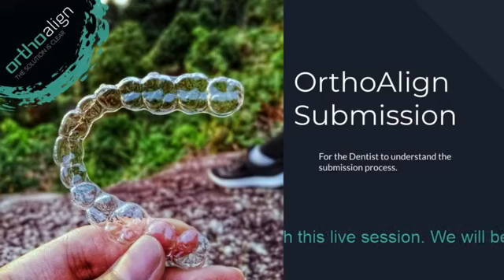If you were to proceed with an impression that is not great, you are definitely going to have tracking issues, fitting issues, and then finally a problem with the actual aligner therapy for the patient, which is going to cost the patient much more money. So it is important to take note of all of this, because if the impression is not clear and is not able to pass our QC check for aligner therapy for OrthoAlign, we will definitely reject it, and we will let you know that you need to retake an impression.